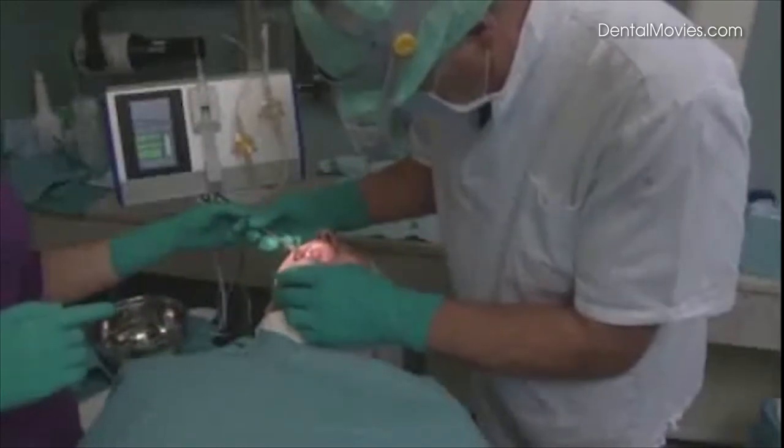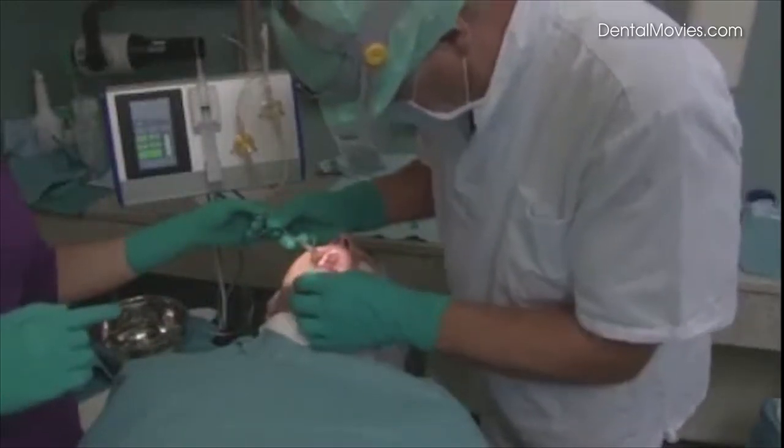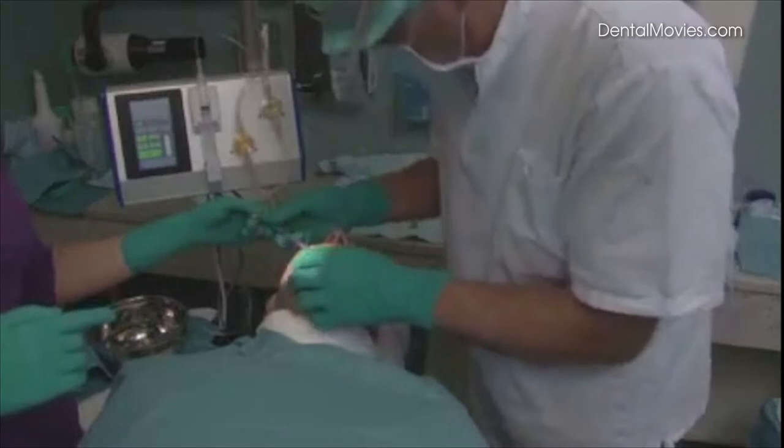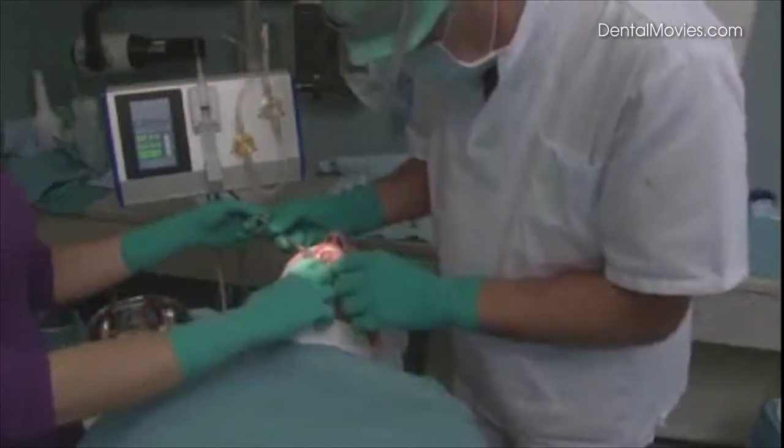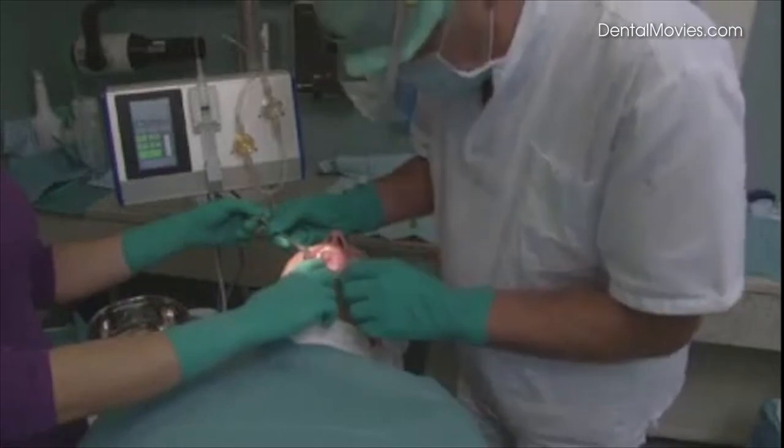This is how the surgery will be done: initially punching the oral mucosa, then drilling the blind hole, and finally the secure first entry into the sinus by applying high hydraulic pressure.